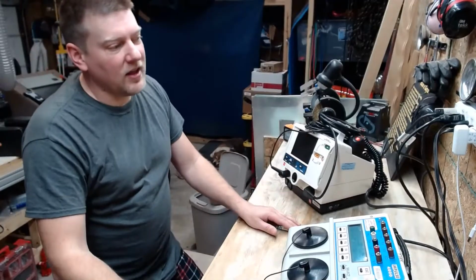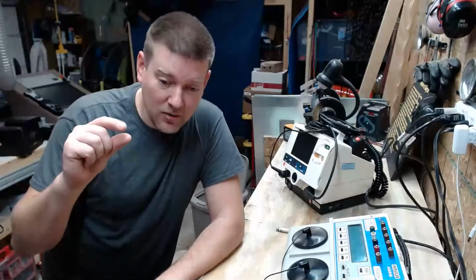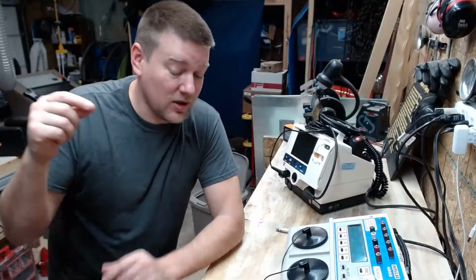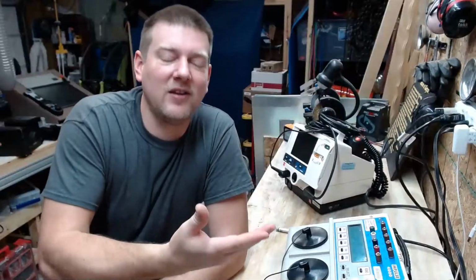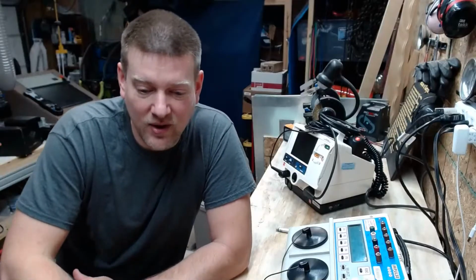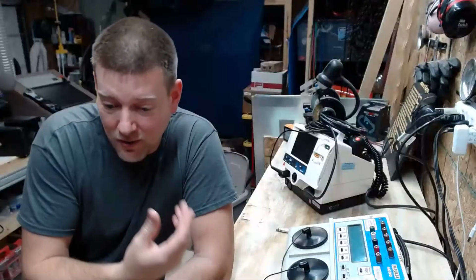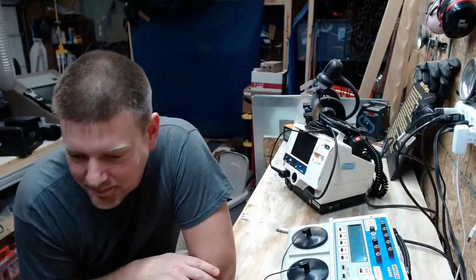They'll tell you, "Oh, that's an irrigation. It's for bipolar. With particular types of tips that the doctors are using, the tips get too hot, so they use the irrigation so material doesn't stick to the tips." It's stuff like that. You find that out by talking to your user. Use them as a resource, guys. And that's why you don't want to make enemies of your users, because it's a synergy relationship.